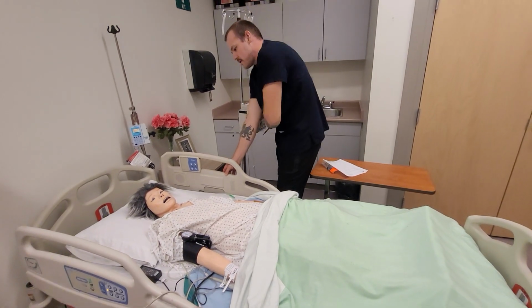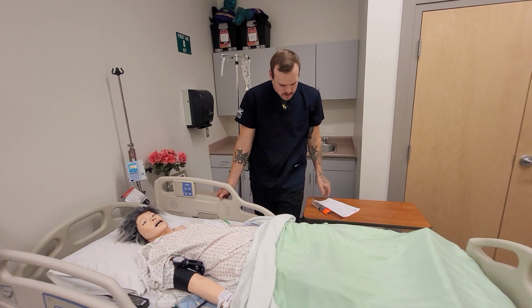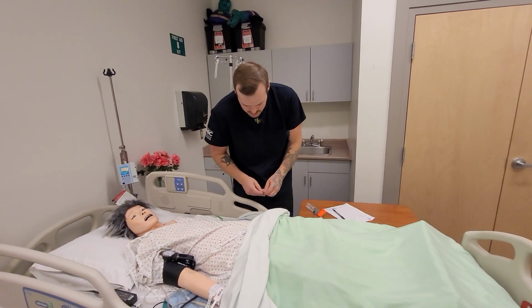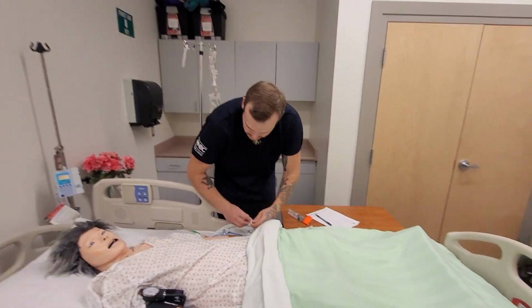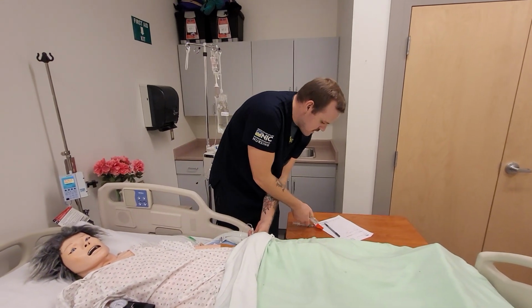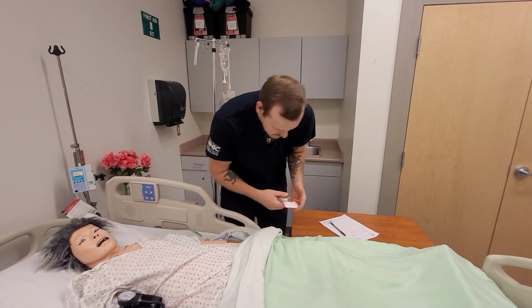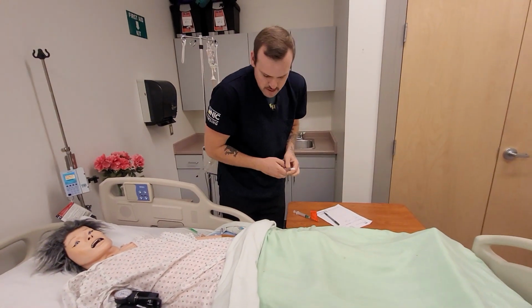We're going to pause our infusion, beep, and it is a compatible fluid with our naloxone. We're going to be cleansing the site for 15 to 30 seconds, and I'm just going to be holding that to get our set there, make sure not touching anything. I'm going to get my normal saline out here so that it's ready.